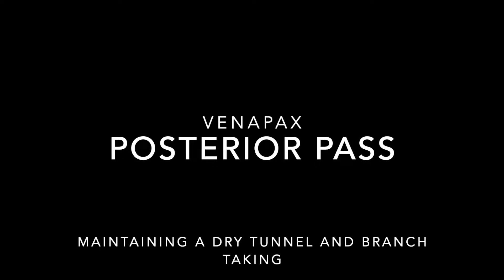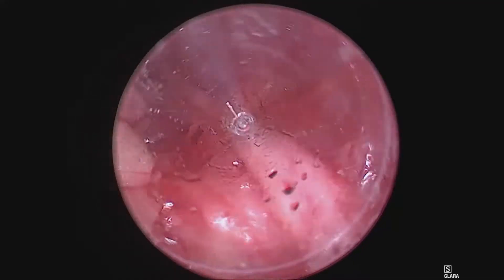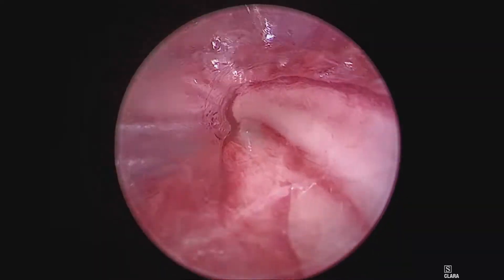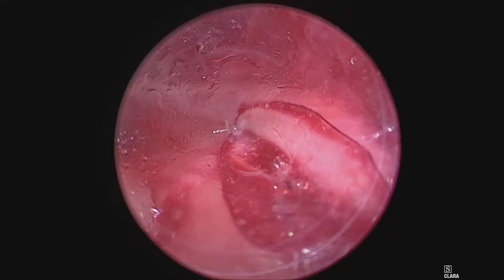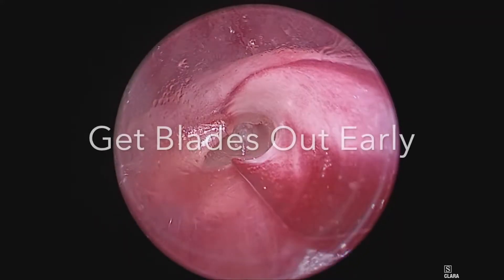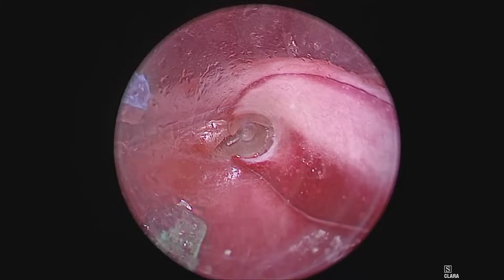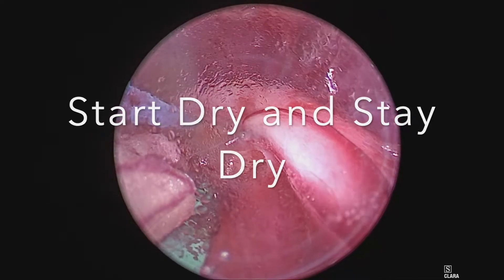In this video, I'm going to demonstrate the posterior pass using the VenaPax system. After creating space above the vein anteriorly, begin your posterior dissection. Begin to make a small window underneath the vein and get your blades out early, and take the adventitia with your blades. This will help keep your tunnel dry. You want to start dry and stay dry.